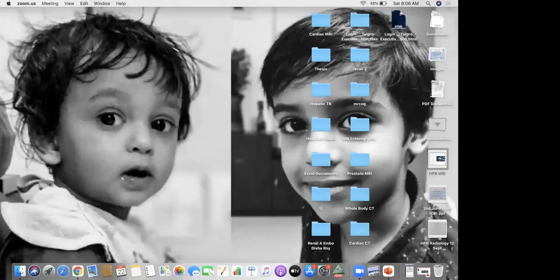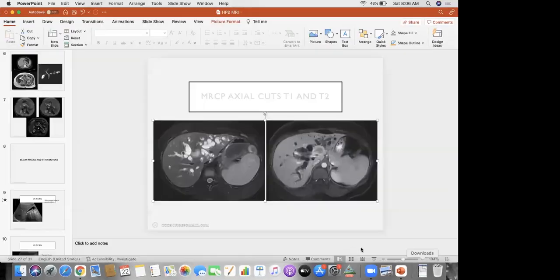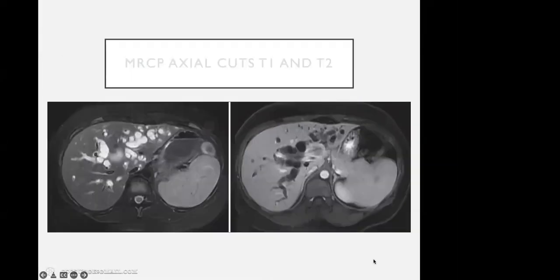All right. So basically, I will start off with the basic MR imaging of the abdomen, and one more thing, please let me know: you are interested in body MR, isn't it? How frequently do you encounter a brain MRI?